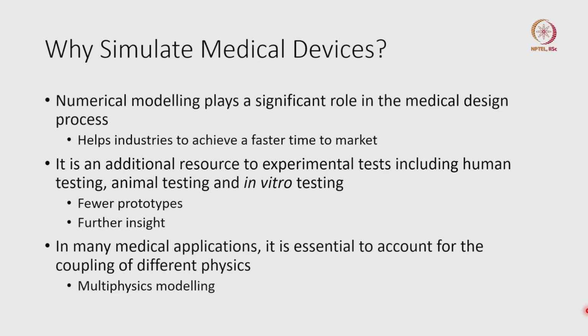Simulating the device helps the industry achieve faster time to market, especially when you have different phases of trials. Rather than doing trials on humans or animals, it is always good to first do a trial with a simulation model, an animal model simulation or a human model simulation.